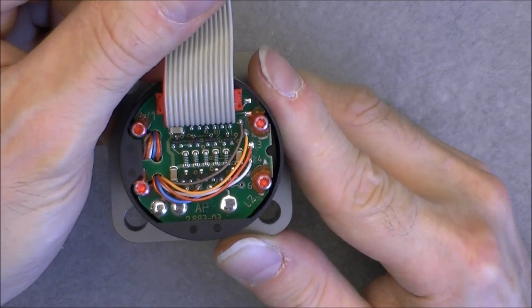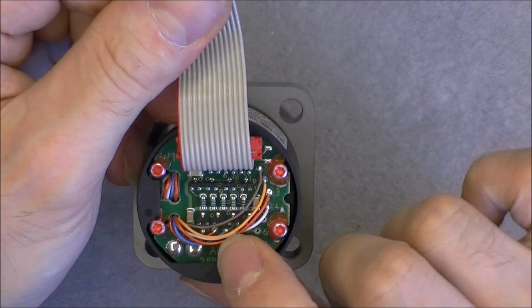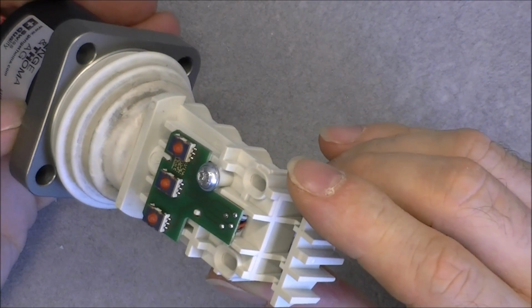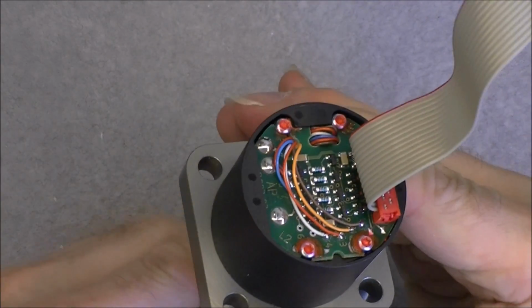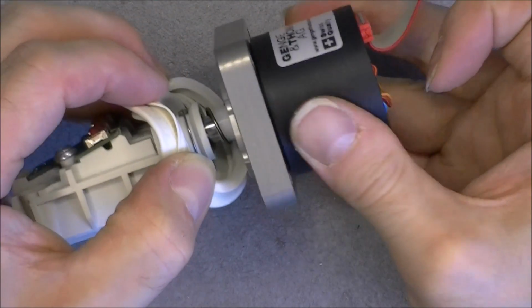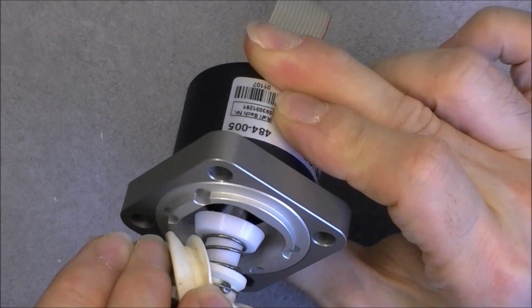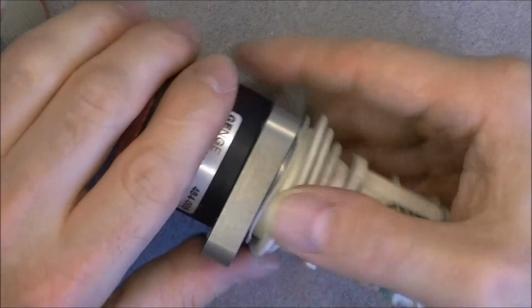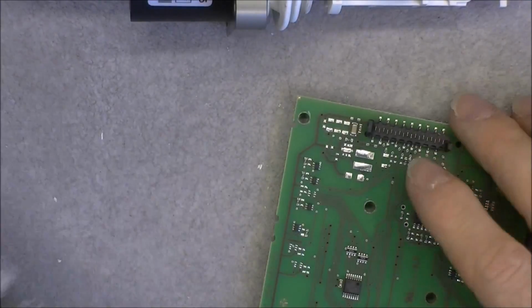We have a little circuit board here with just resistors, transistors, caps, and a few wires, which must be coming from here, through, yes, it moves a little bit here, so they must be routed through this center shaft. As you can see, very nice mechanism, by the way. So this one is very clean inside, so I will not risk breaking it. But before assembling, I will clean this piece because it is dirty. So here are all of the electronics for this thing.